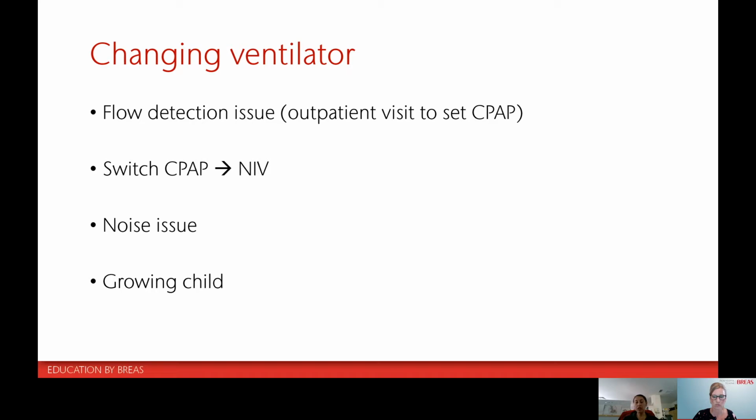So you can change the device and, for example, try to put an intermediate or level 2 device. And if it's not enough, you will try a life support device. So this is one of the cases.